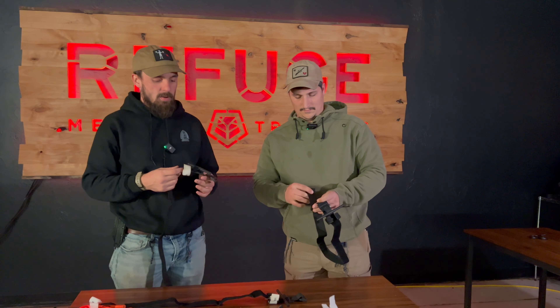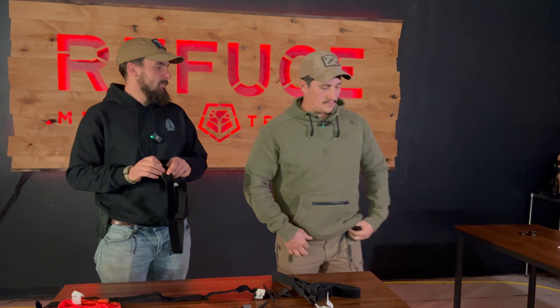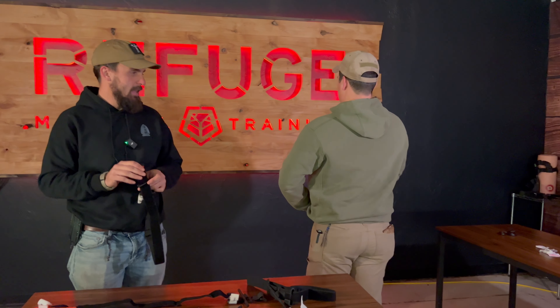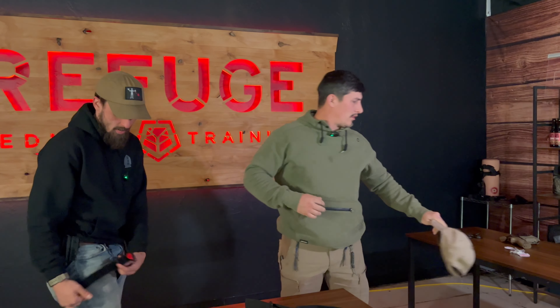So why does this matter? Why can't you just buy four tourniquets for 20 bucks on Amazon and be totally fine? Well, Heath is here to show you exactly why you can't do that. He's got one of our super reliable tourniquets and he's going to demonstrate.